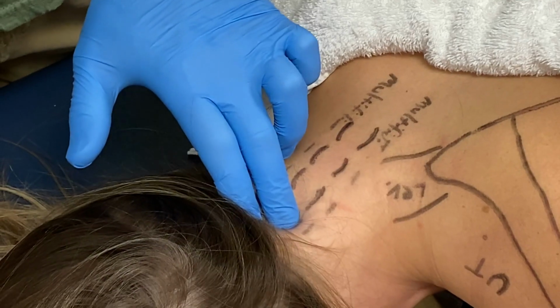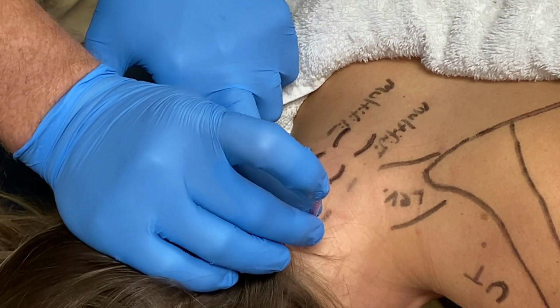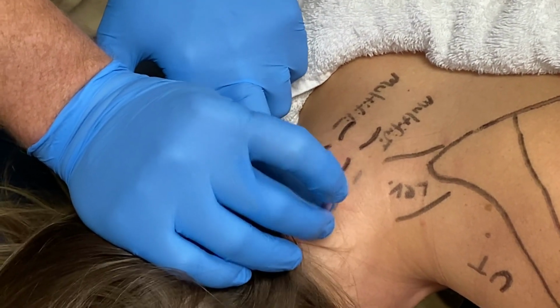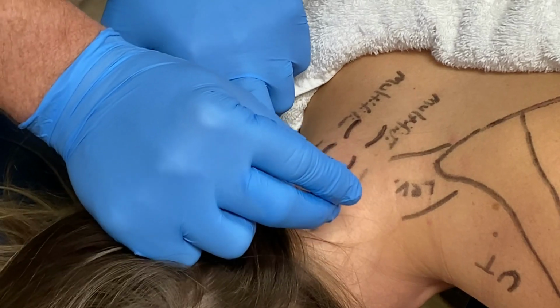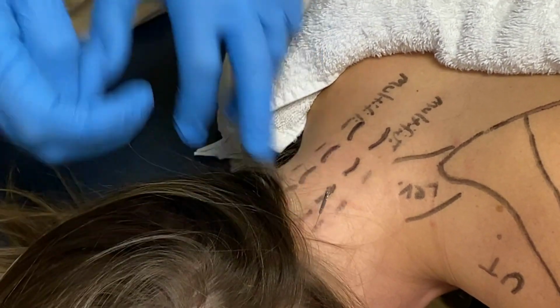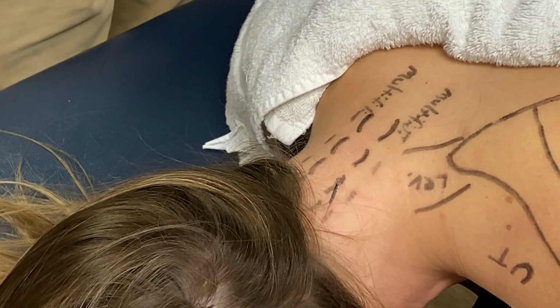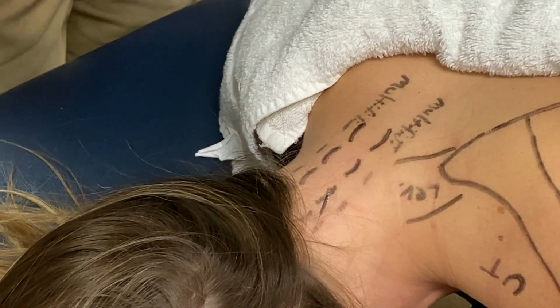So I'm going to go ahead and hit that C2. So I'm going to leave my finger on the edge of the spinous process, 1 finger width out from the edge of the spinous process. We'll tap this in, little tap. If this is vertical, here's my slightly medial. And there's her lamina. She's nice and little. Makes me shake every time.